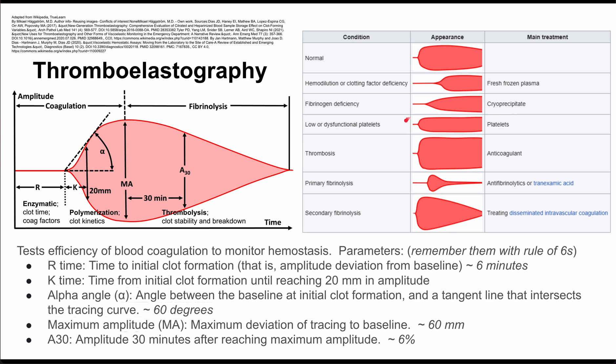If your thromboelastography curve looks like this, you might have low or dysfunctional platelets, and of course you want to replete those platelets.